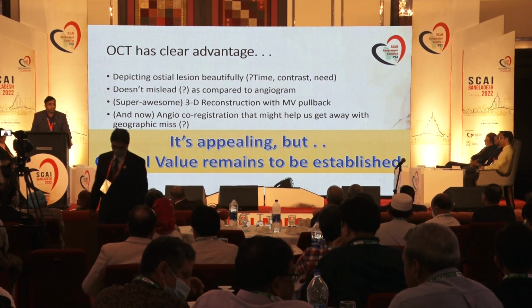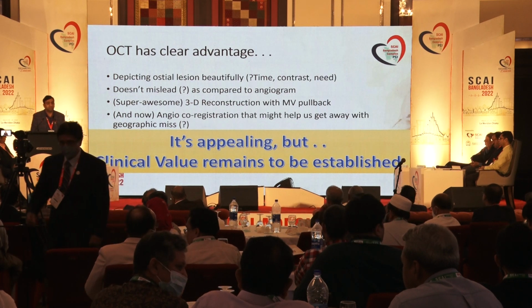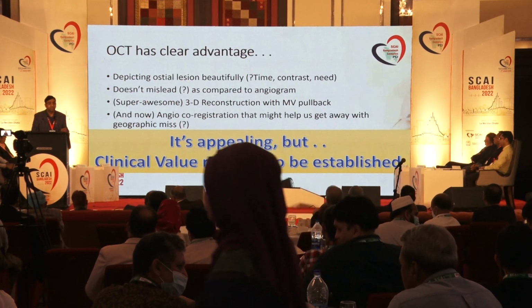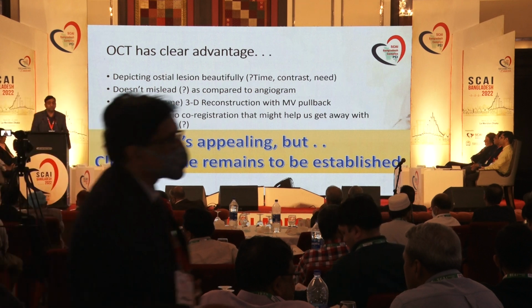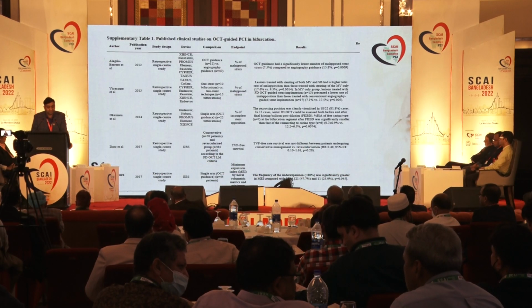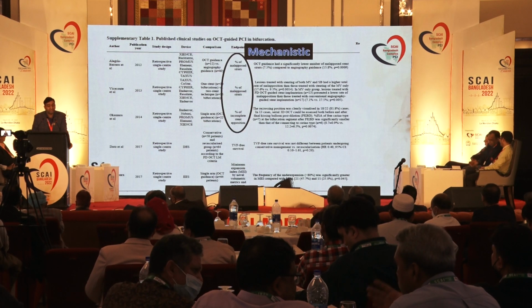But I would like to question how many times we would assess the ostia before the procedure, during the procedure, after the procedure, especially if there is a side branch critical stenosis, whether or not we will be able to image its pullback nicely.